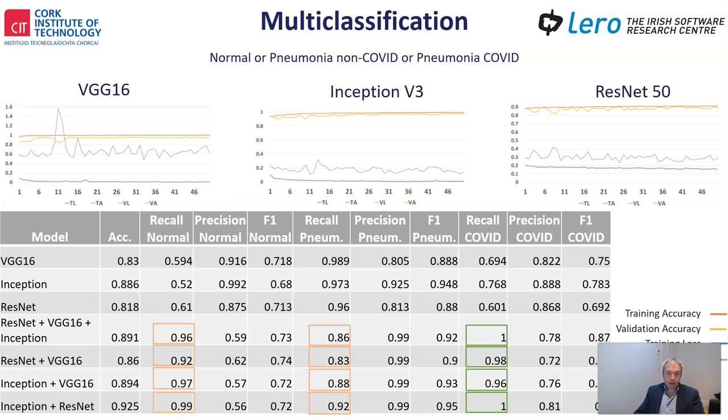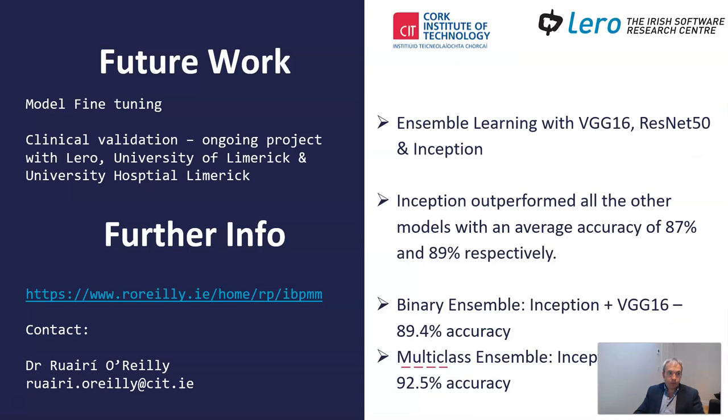An encouraging finding is the improvement of recall in the detection of COVID-19 using the ensemble-based approaches when compared to the single models. Considering the impact of COVID and that our approach is intended to assist radiologists, we can live with false positives as they do not contribute to potential spread, while false negatives would be a serious concern. However, the variation in recall across the three classes must be investigated further.